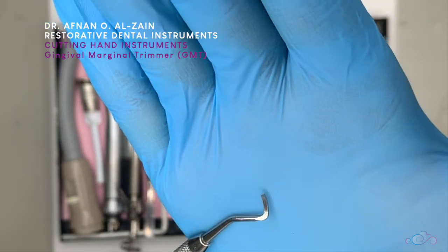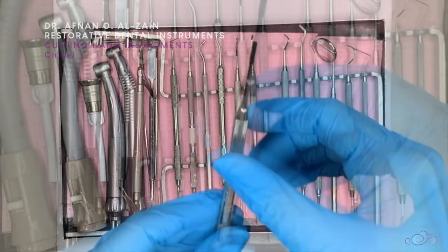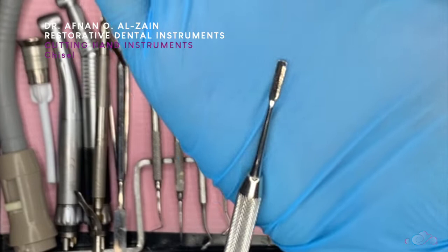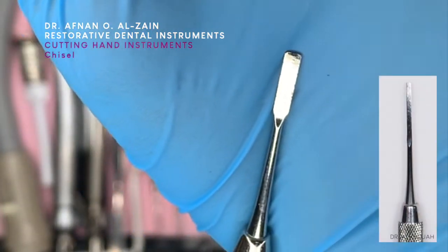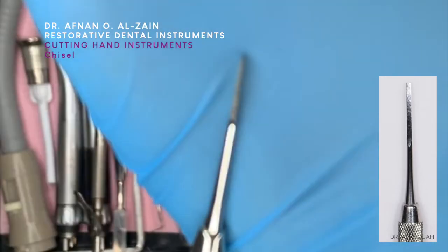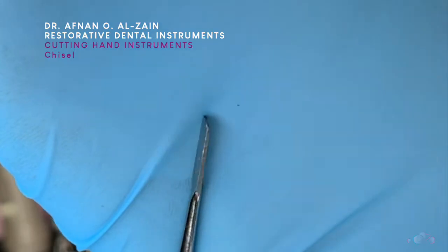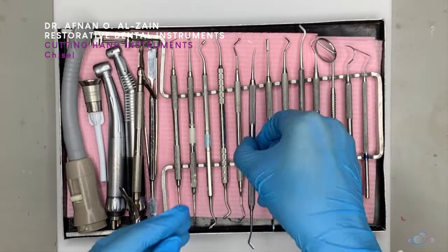The GMT is usually used to cleave or remove the unsupported enamel at the gingival margin. After that we have the chisel. We can see how it is different from the other cutting instruments, and it has the same function as the enamel hatchet.